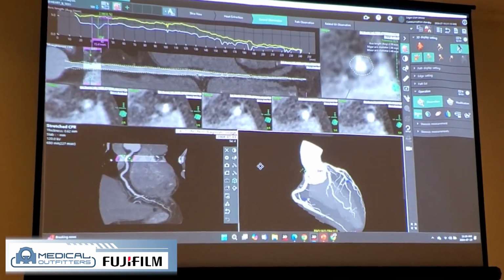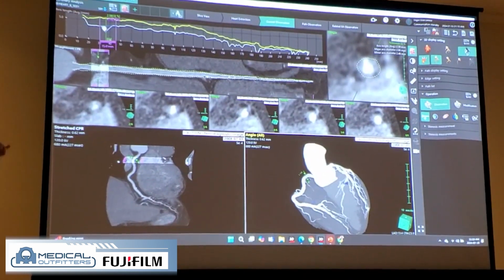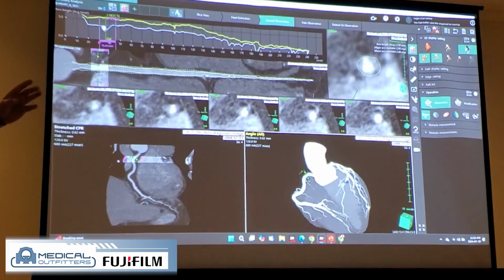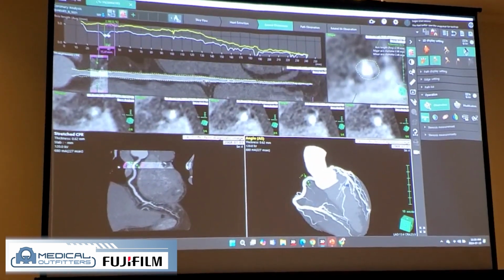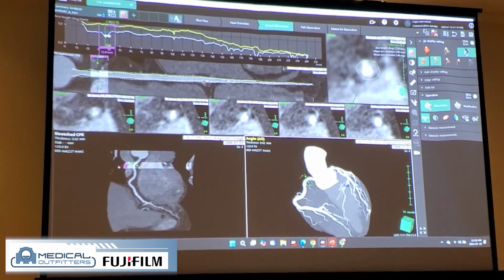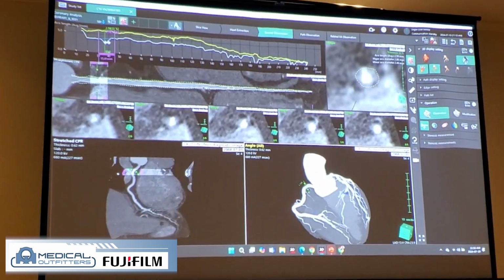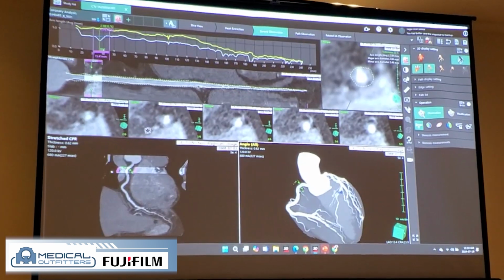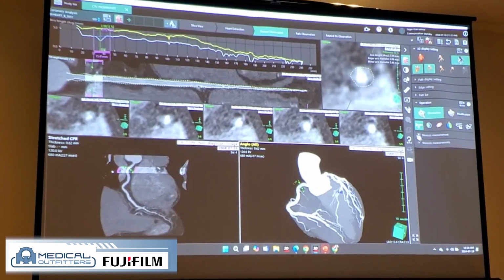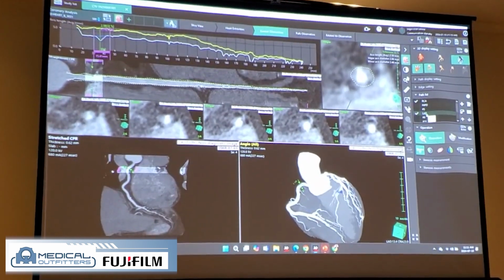This one over here is going to give us a global view. Like I said, this is the histogram. If you look at this histogram on each of the vessels as you come across, you can see that first part right there, there's a little bit of a drop in the beginning, and that drop is represented by that stenosis or that soft plaque where the contrast doesn't completely fill it out. So if I come over to the second one, I've got a list of them here, right? I've got a whole path.